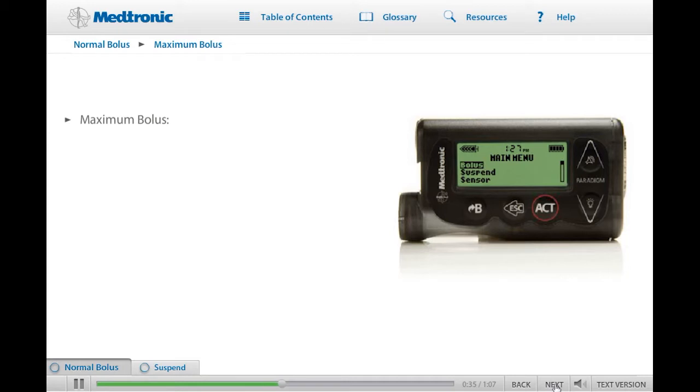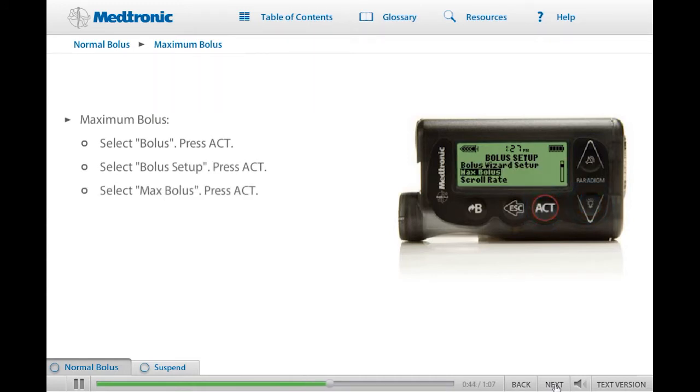To change the maximum bolus limit from the factory default setting, start on the main menu. Select Bolus and press Act. Go to the Bolus Setup and press Act. Scroll down to select Max Bolus. Now you are on the Max Bolus Setup screen. Use the Up and Down buttons to set your maximum bolus amount. Press Act. Your maximum bolus limit is set. If you would like to practice, try setting a new maximum bolus on your pump now. When you are ready, click Next to continue.